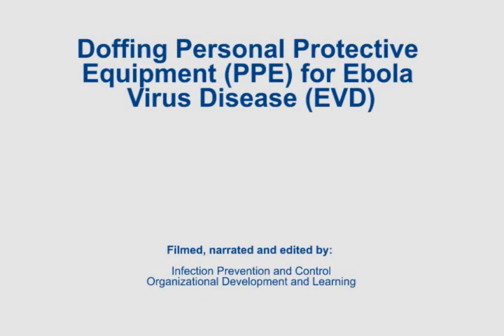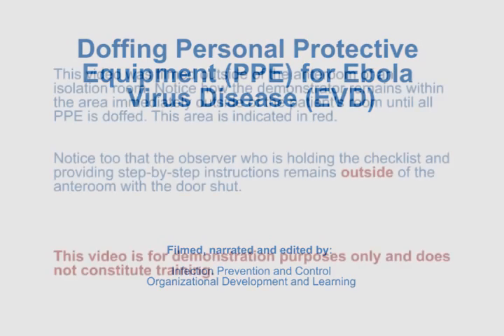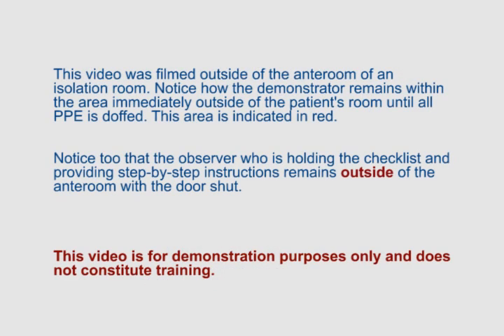Doffing personal protective equipment for Ebola virus disease. This video was filmed outside of the anteroom of an isolation room. Notice how the demonstrator remains within the area immediately outside of the patient's room until all PPE is doffed. This area is indicated in red.